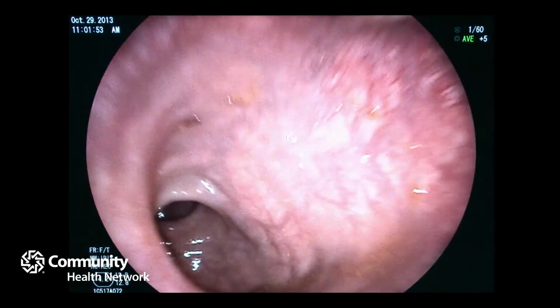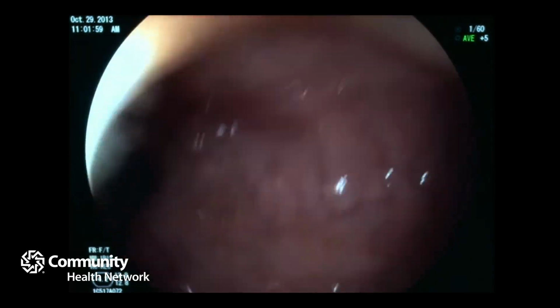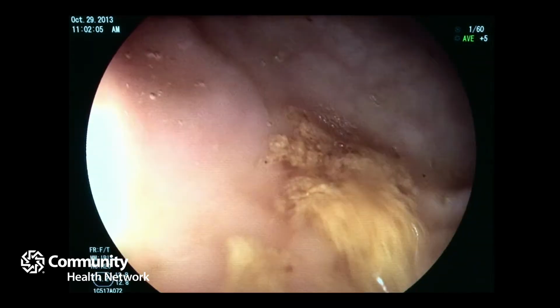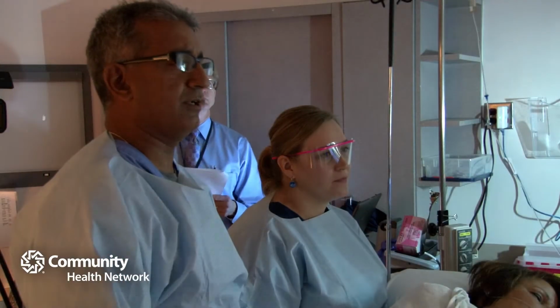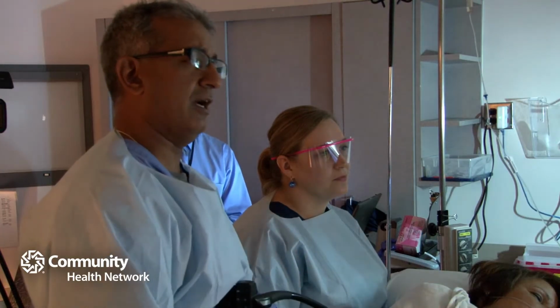What I'm doing here is I'm just starting into the rectal area. These are valves, so there's usually 3 valves in the rectum, 1, 2, and then I'm going to make a turn and there's 3. And we're just going through the rectum right now. The prep is fair right now, we're suctioning some of the stool out. And there's variable techniques people can use. Some people suction more, some people push more. It's all how you're trained.